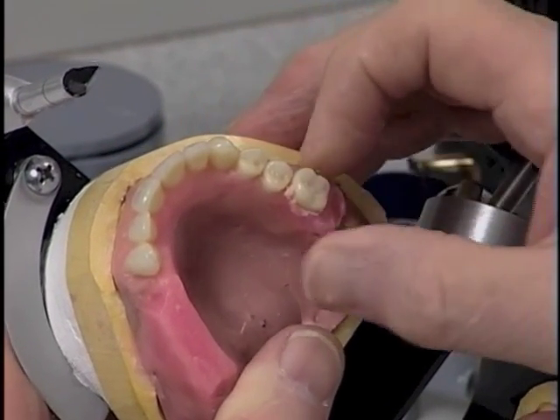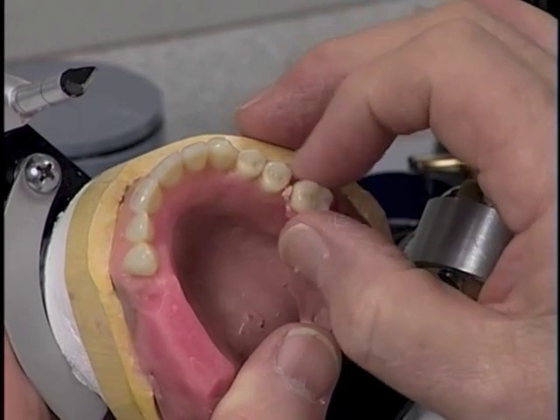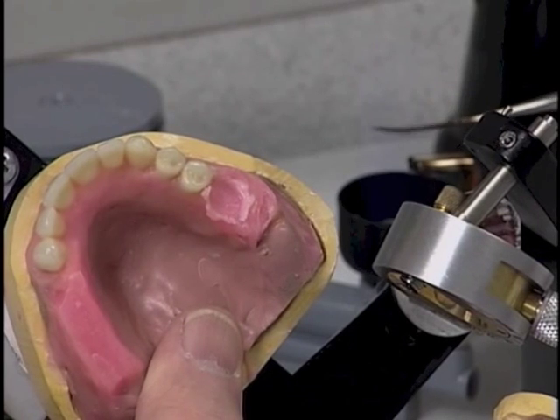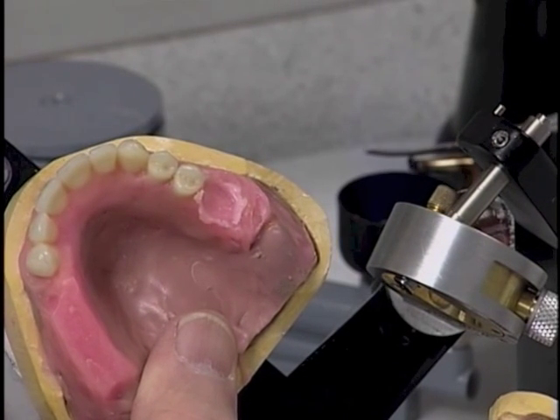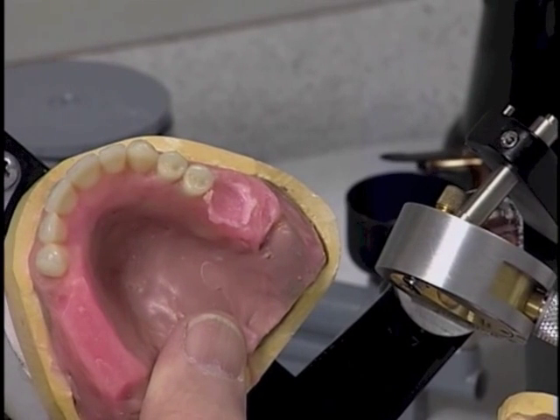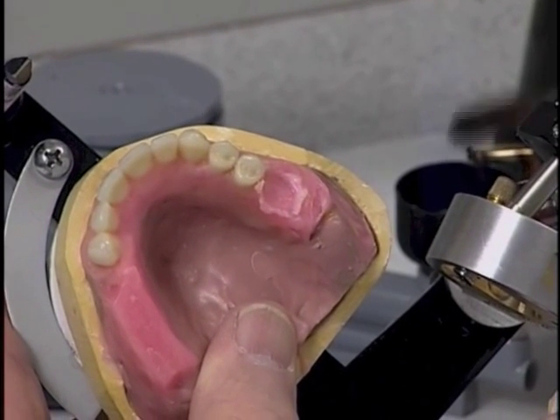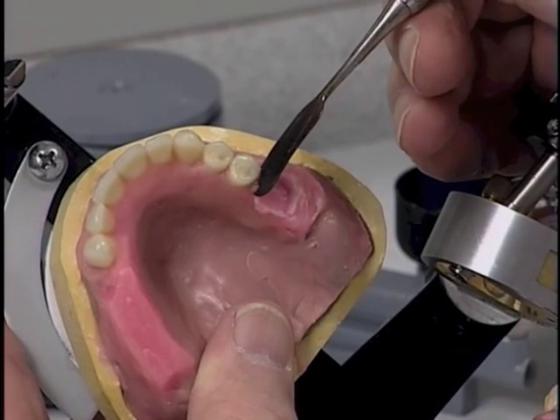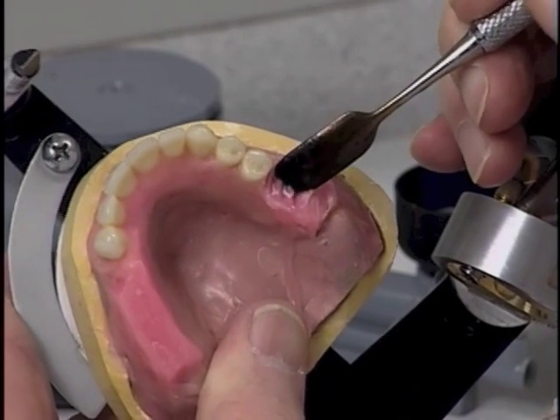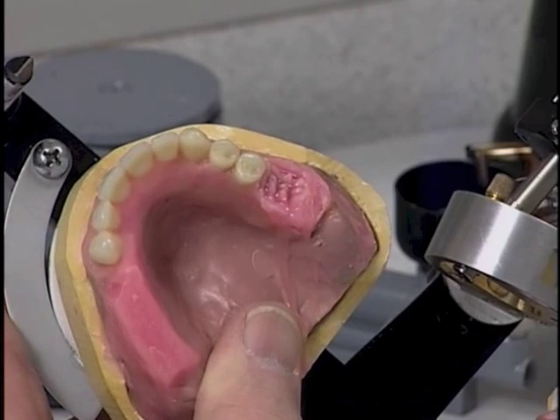And the way I like to do this is to more or less mash those teeth into place. And we do that, but once we have the wax soft enough to be able to manipulate the teeth well, what we're going to do is hold the maxillary molar to keep it from sliding buccally on us and close the articulator into full occlusion, and let that dictate the position then of where that maxillary molar is going to be.